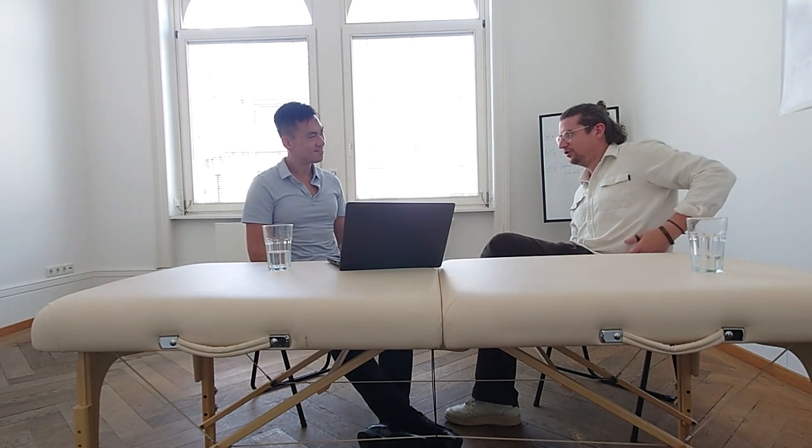It depends, because let's focus for example on running sports. We have mainly 4 muscle regions which are really important for us. This is the gluteus medius, the hamstrings, the vastus medialis lateralis, and the peroneus longus. The majority is not that bad in activating the vastus, the quadriceps and the hamstrings. Most people have an issue controlling the gluteus medius and the peroneus, so the foot pronation.